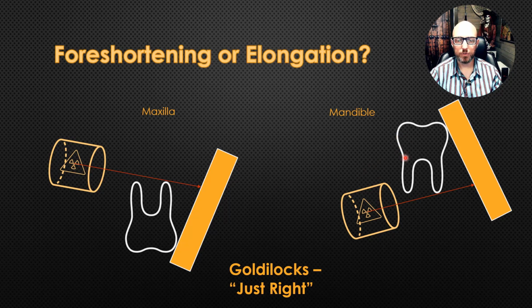And you're better able to see the structures you want. You can measure the structures you want. So it's an excellent method to know for when doing endodontics, and those measurements are critically important for getting the right length of your canal. All right, short video.